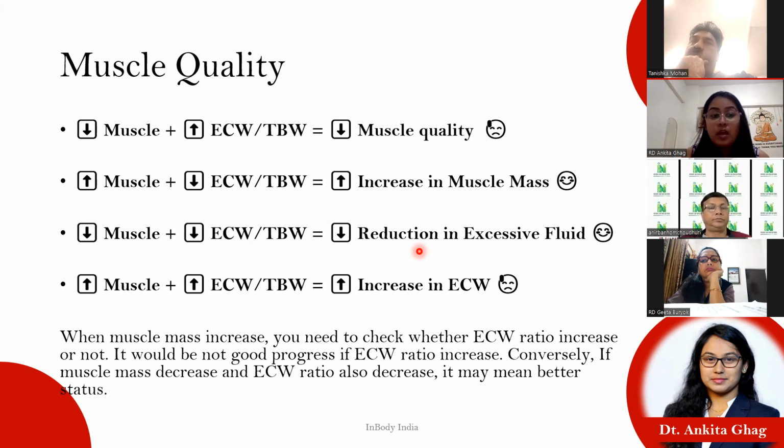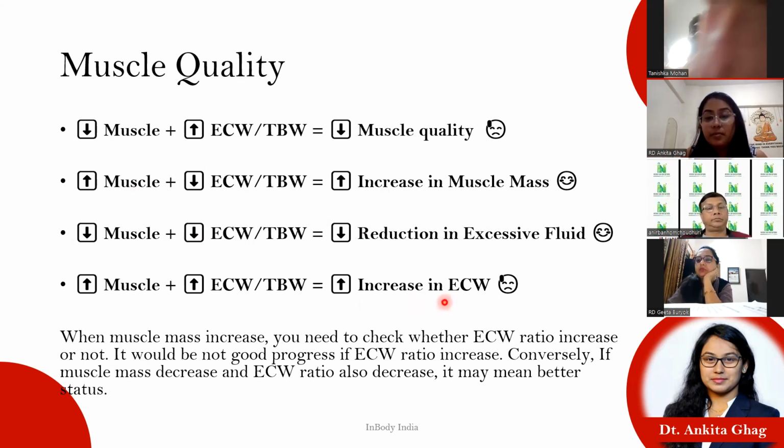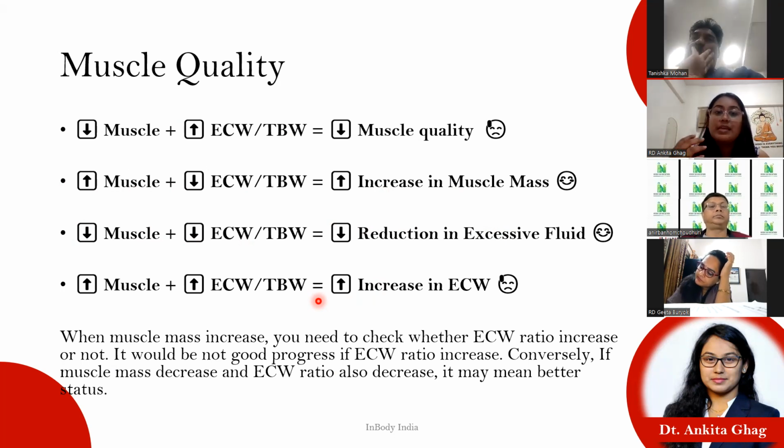down. Then there is a condition where the muscles are going up and extracellular water is also going up. That indicates an increase in the edema seen in this patient. So it's very essential that we work up and see to it that the person is not going into inflammation. Accordingly, the management can be planned for this individual. So it's very essential to monitor muscles, not on the basis of fat, but with the water levels, in order to understand the quality of the muscles and inflammation.